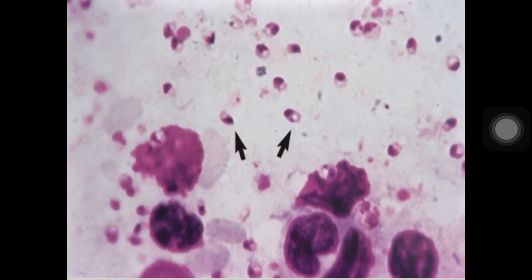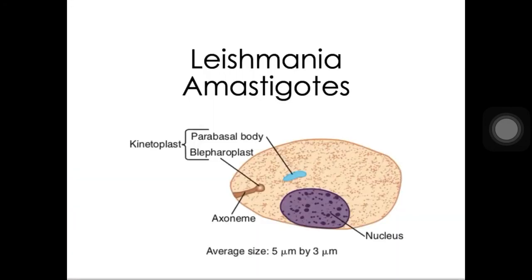So this is the first image, for parasite number 19. Okay, did you get it? Are you familiar with the image, or rather, with that parasite? This one is simply showing the amastigotes of Leishmania. We have four forms of hemoflagellates: amastigote, promastigote, epimastigote, and trypomastigote.